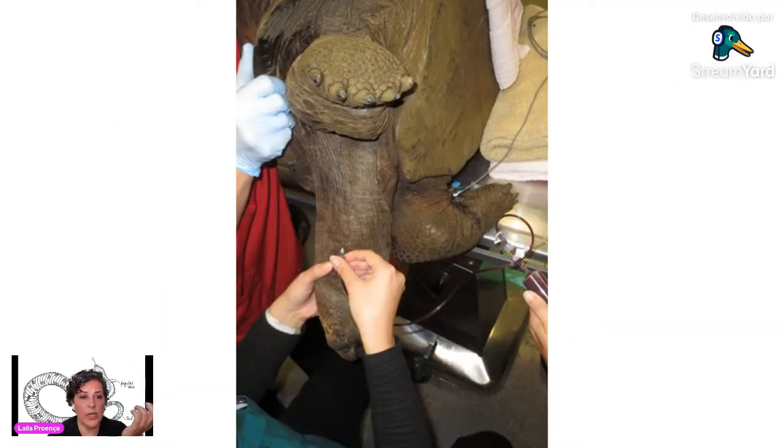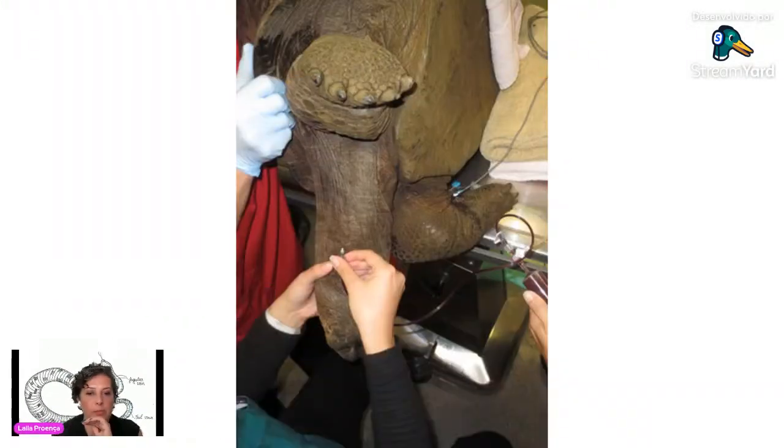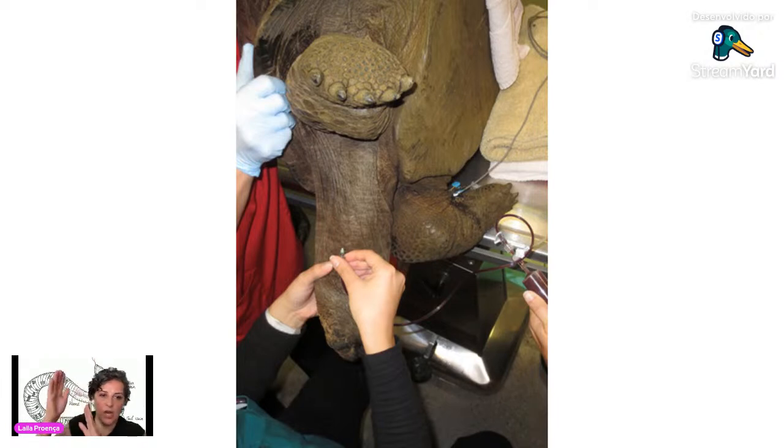From our chelonians, as I said, we can definitely collect from the jugular vein. And here's a tip for you. This is a huge Aldabra tortoise, but the reason I want to show you this picture is that you can use this technique of putting the head down. As you can see, there's a table there, and the animal is on the table, and we are tilting the animal so that the head is angling down. So the blood goes to the head and usually makes the jugular pop, because holding off these veins, unfortunately, doesn't help much. So I really like to do that.